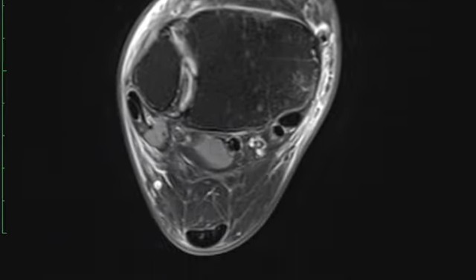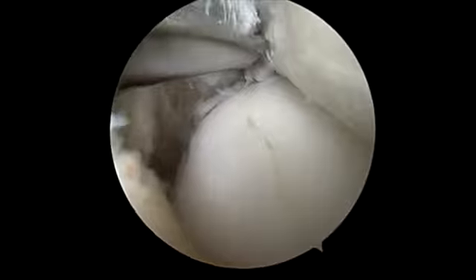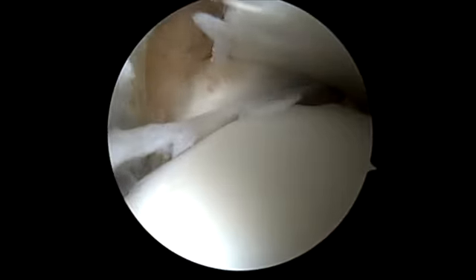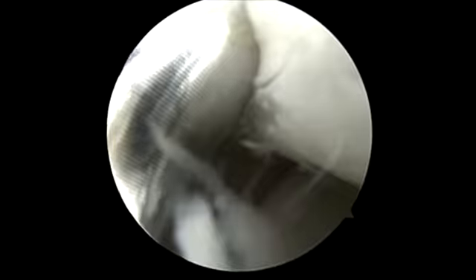The view from the anteromedial arthroscopic portal provides vision into the ankle joint and lets us assess damaged structures. Preparing suture anchor implantation site with a shaver. The guide is applied to ensure optimal anchor placement in the tibia. Then an implant is inserted.